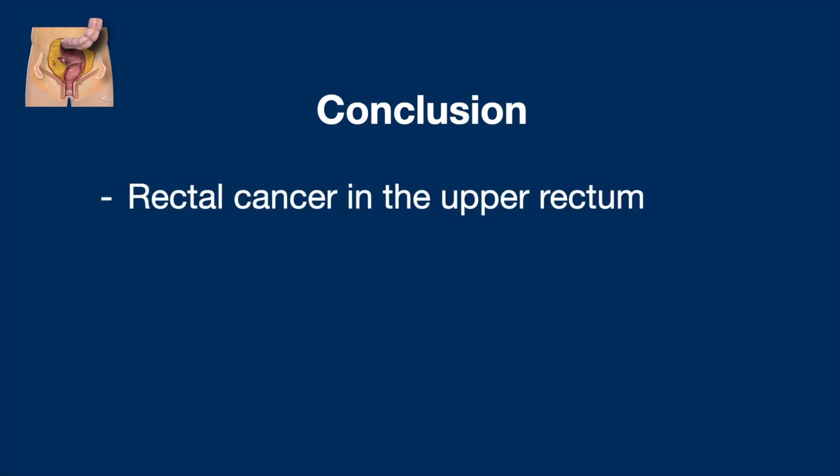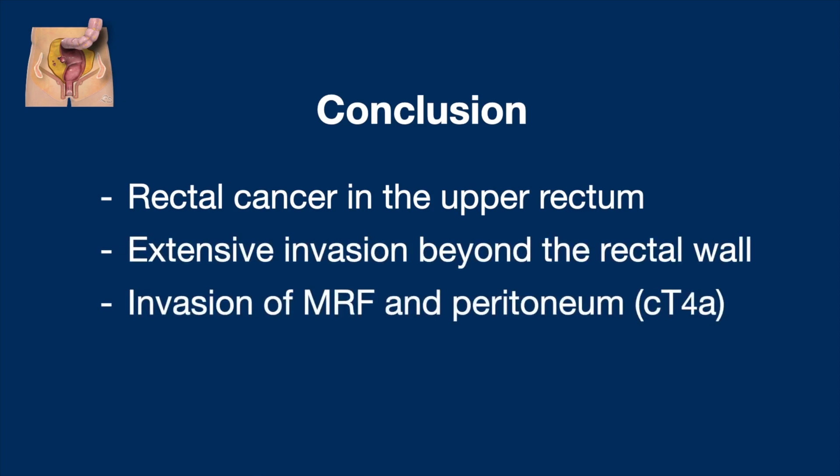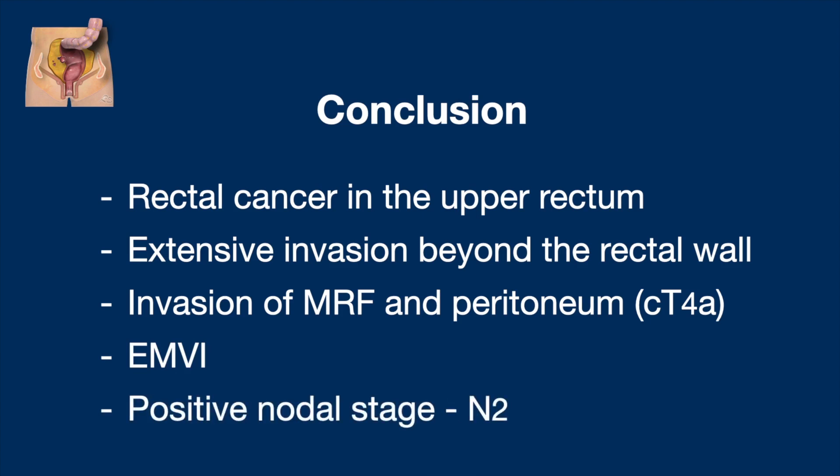So the conclusion is: we have a rectal cancer in the upper rectum with extensive invasion beyond the rectal wall, invasion of the mesorectal fascia and peritoneum indicating clinical stage T4a, extramural vascular invasion, and positive nodal stage N2.